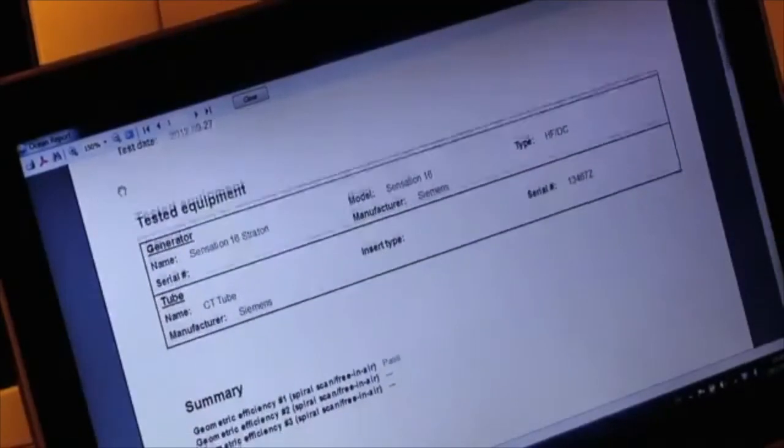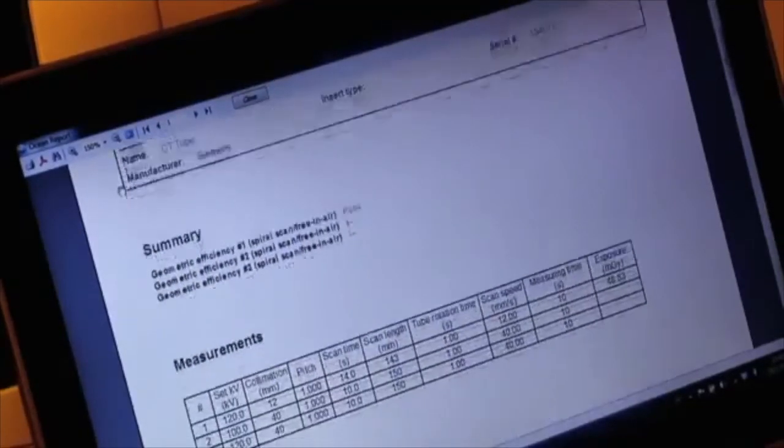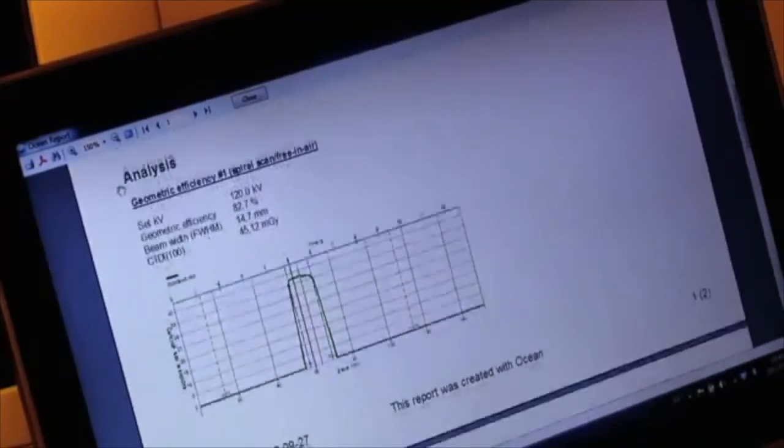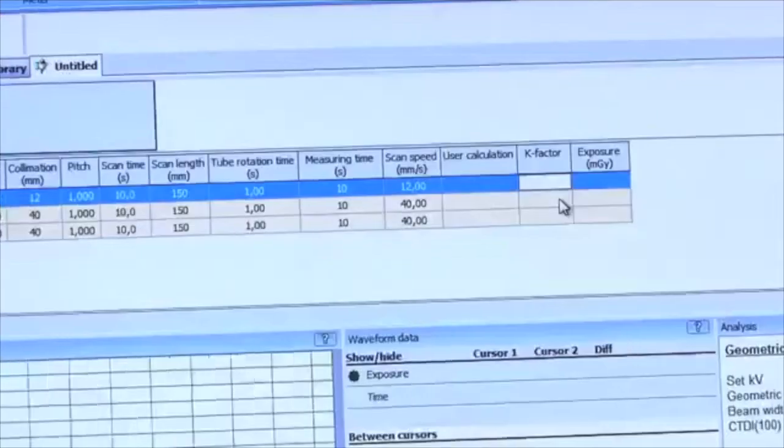To print a customized report, just go to Reporting. For Ocean professional users, you can of course customize the measuring template any way you like.